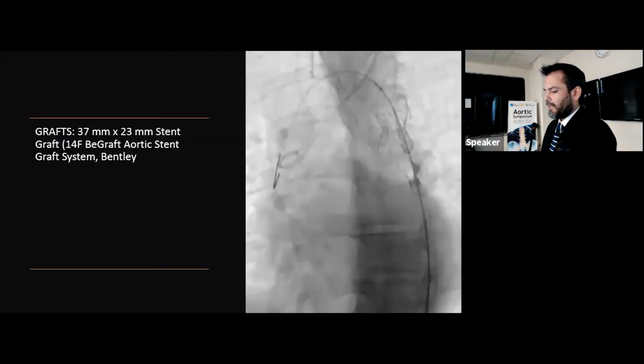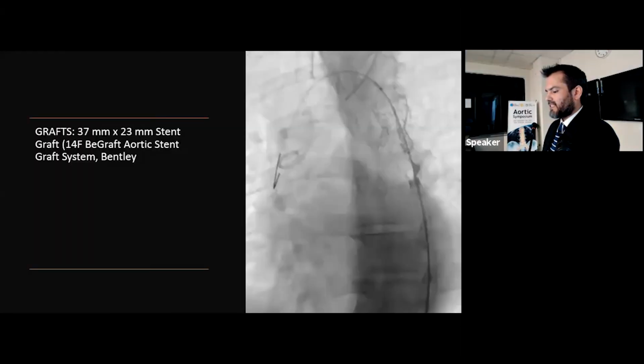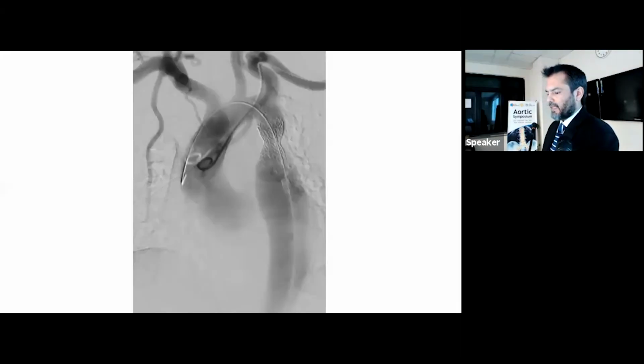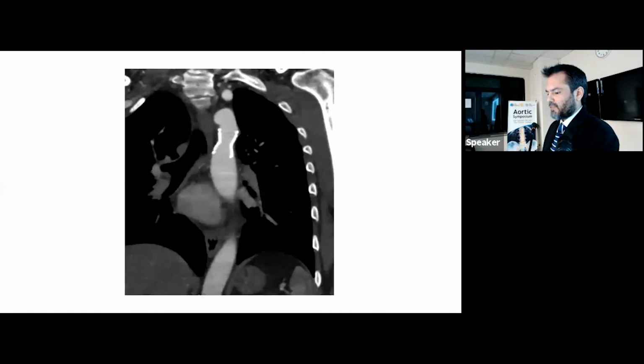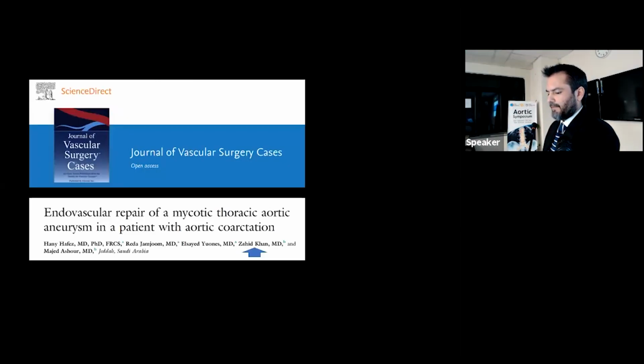He does very well. Notice that we don't fully inflate the balloon. I like to keep an hourglass appearance, and that's to stop stent migration. So by keeping that stent graft in that position, it is not going to migrate. And that is the reason behind not fully deploying it. And this is the largest size short stent graft available. And you can see here the final images over there. And again, he's also done very well.